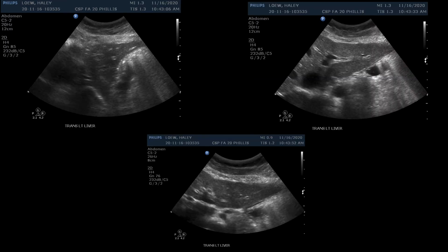We also imaged the left lobe in transverse at different levels as well. Be sure to show heart at the superior level, ligamentum venosum at your caudate level, and ligamentum teres at your inferior level. I think I could have found a better window to image the caudate lobe here, as well as decreased my depth on my trans left liver inferior image.